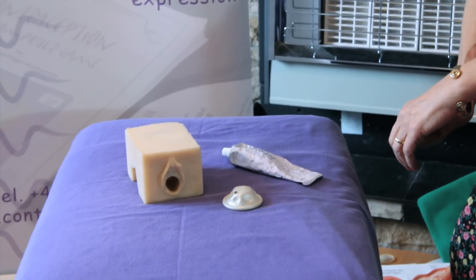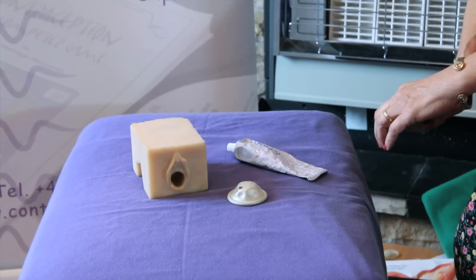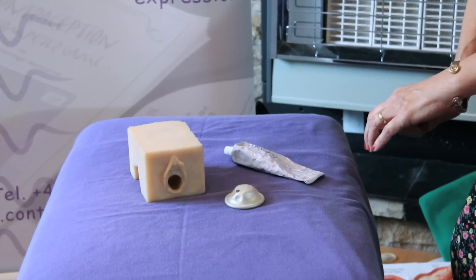We're now going to look at a barrier method of contraception for women, which is called the diaphragm. This is one of two methods that are very similar. One's the cap, which fits over the neck of the womb, and one's the diaphragm, which goes right up inside the vagina and sits in between the pubic bone and the back of the neck of the womb.